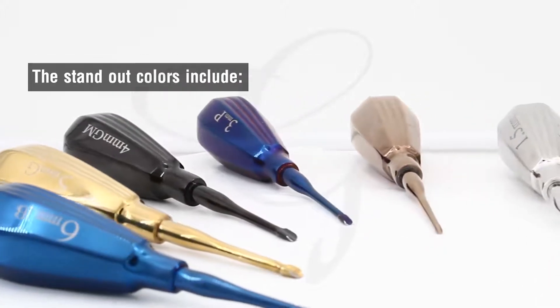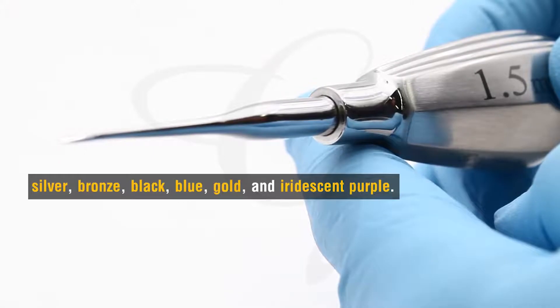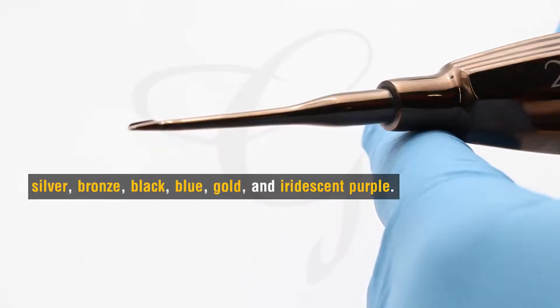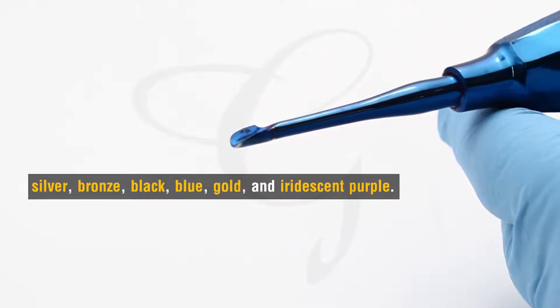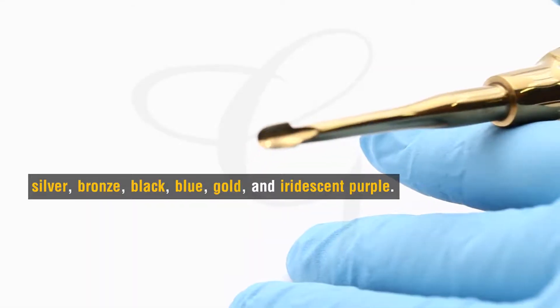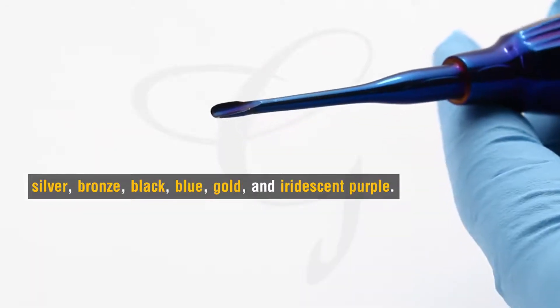The standout colors include silver, bronze, black, blue, gold, and iridescent purple.